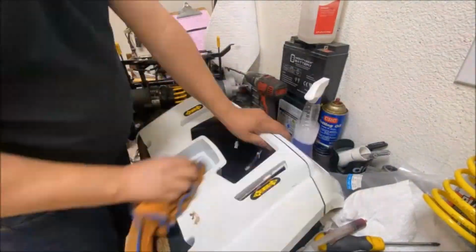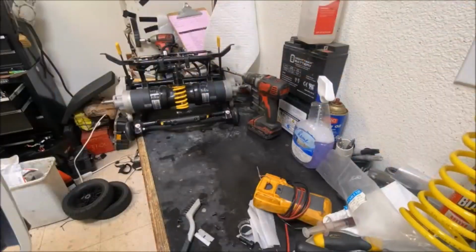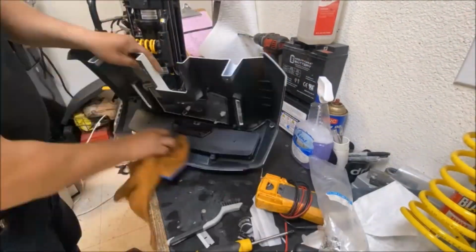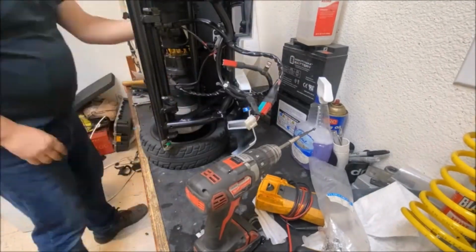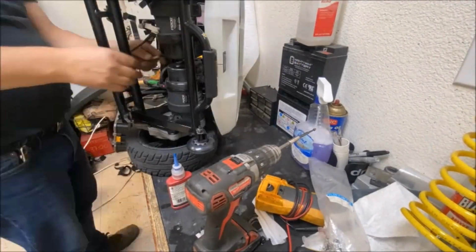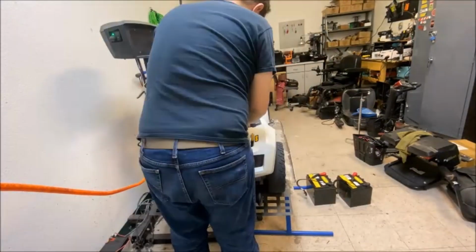The only other thing to look for on the back of the scooter, or in this case the ZT10, is any wire damage, any cables that are hanging down, which there were in this case.